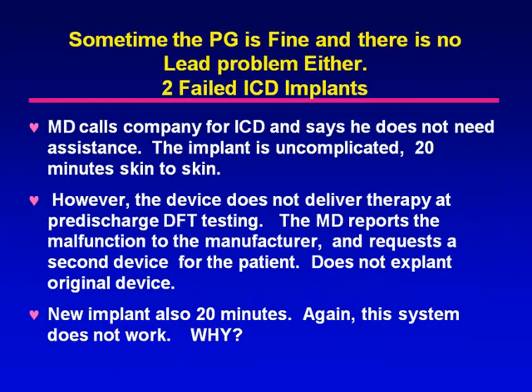This is a rare case. Sometimes, in fact, the pulse generator is fine, and there's no lead problem either. In this case, the doctor called the company about an ICD and said he didn't need any help. In fact, the implant was uncomplicated. However, the device did not deliver therapy when trying to do testing. He reported the malfunction to the manufacturer and said, give me a second device. And he didn't bother picking up the first one.